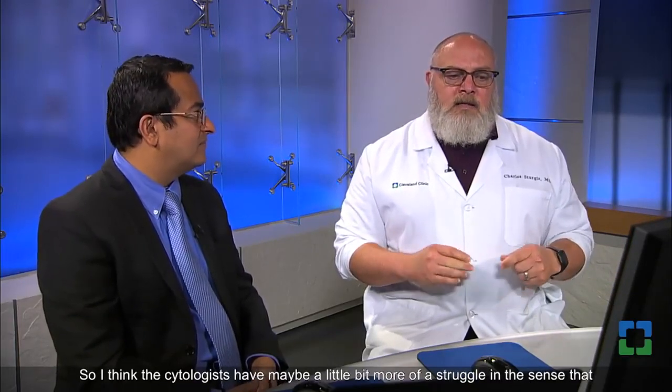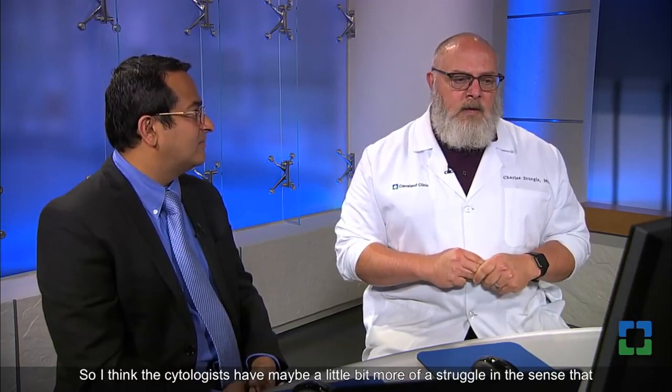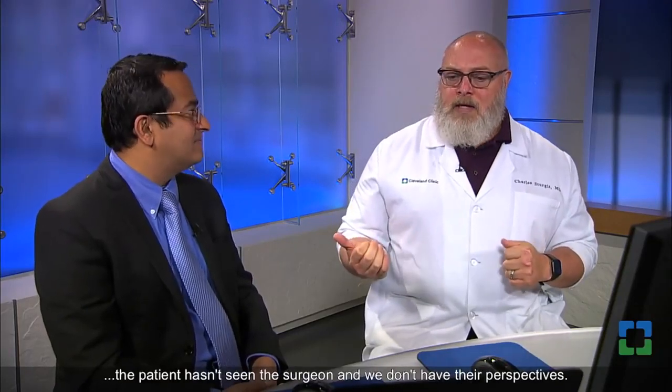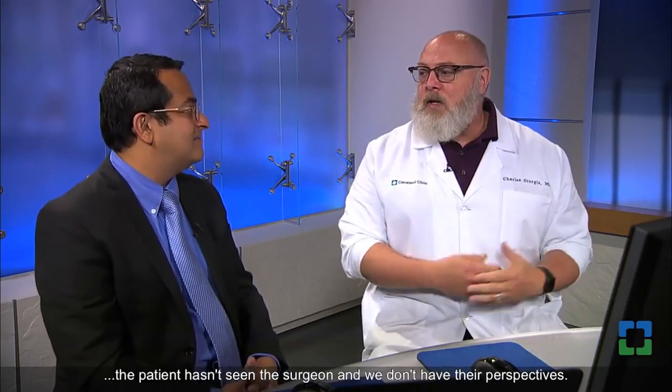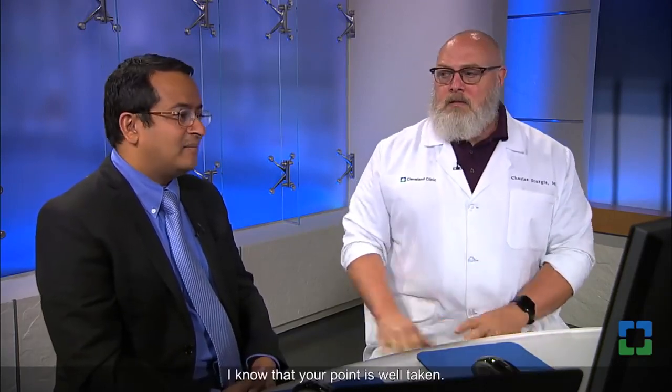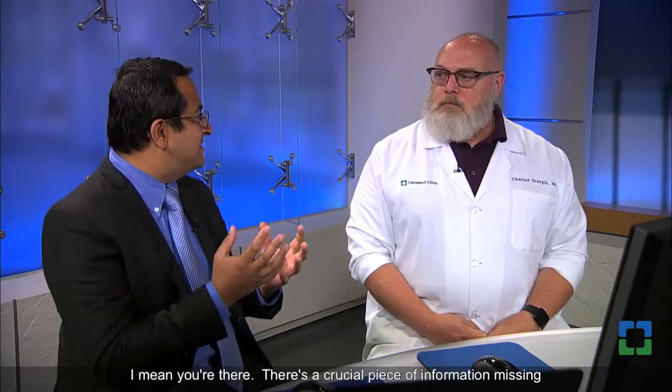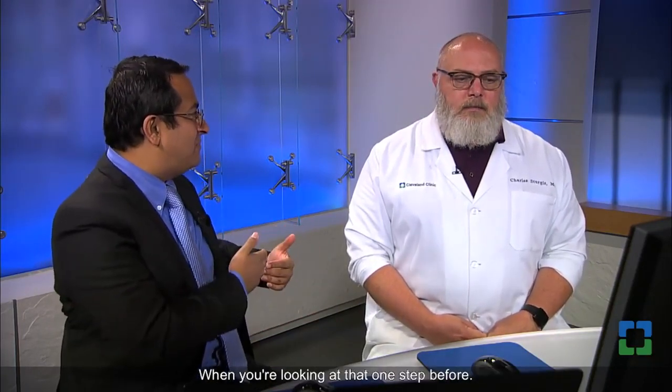So I think the cytologists have maybe a little bit more of a struggle in the sense that the patient hasn't seen the surgeon, and we don't have their perspectives. Yes. Sorry to interrupt. No, your point is well taken. I mean, there's a crucial piece of information missing when you're looking at one step before.